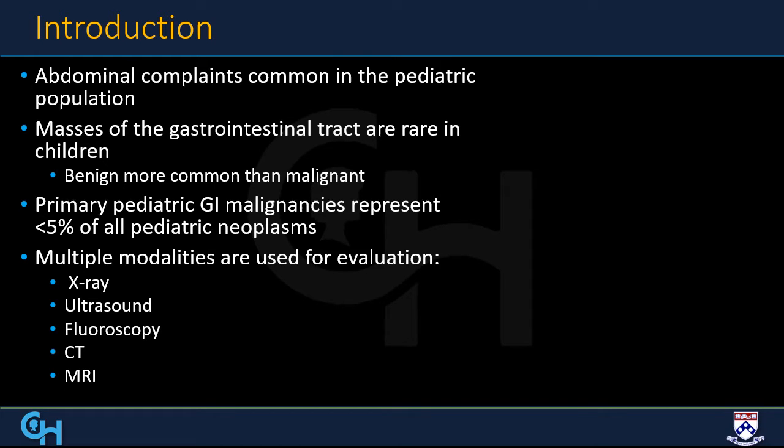Multiple modalities are used for evaluation, usually when a child presents to their pediatrician or the emergency room with abdominal complaints. An x-ray is obtained, but that is very insensitive for evaluation of gastrointestinal masses. Much higher yield modalities, of course, include ultrasound, fluoro, CT, and MRI.